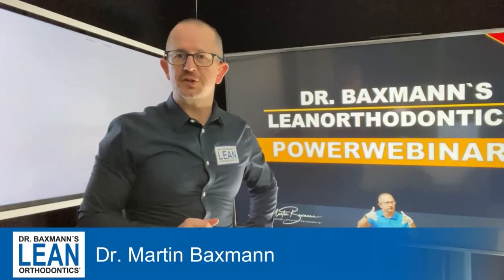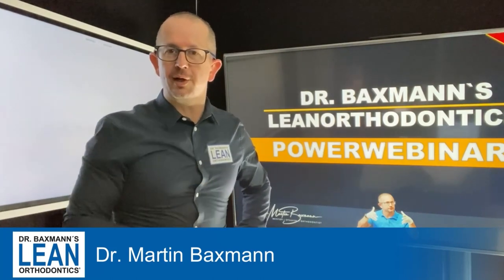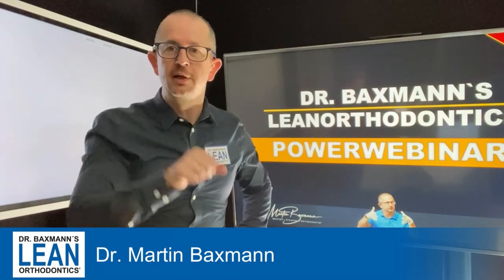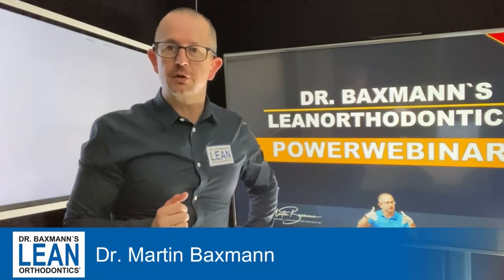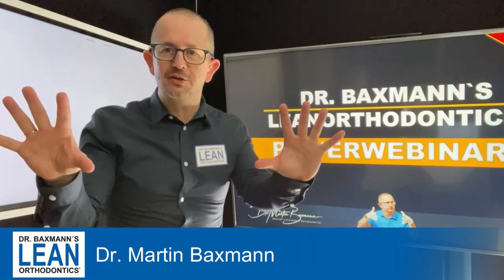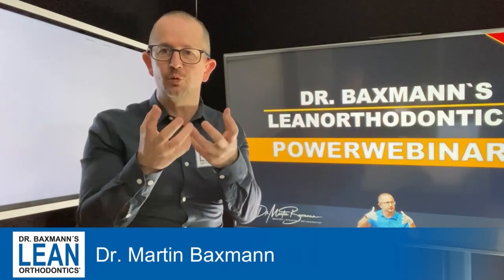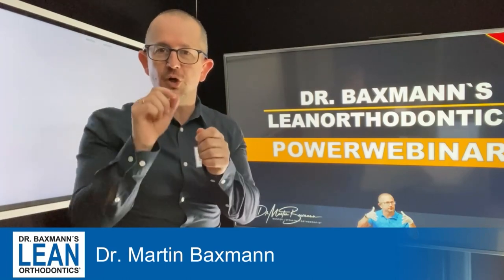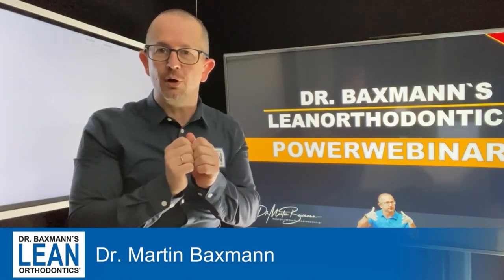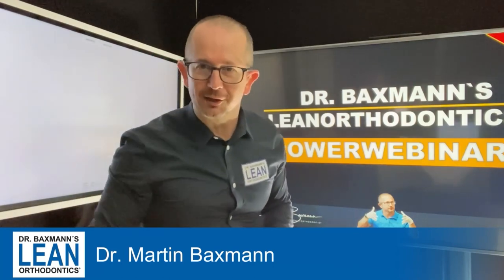Welcome to my PowerWebinar Series. Today we are contouring the upper incisors because they are not really in shape. We straightened them nicely with orthodontics but there is still a little bit of tricking left that we can do. What you are going to need is your handpiece and a diamond burr, and a patient with worn edges on the front teeth. Now let's get down to action.